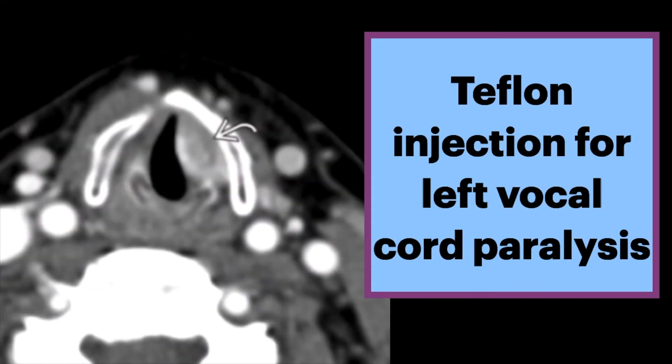There are a variety of treatments, including Teflon injection, which is shown here. This axial CT shows an amorphous high density in the left true vocal cord. Review of the history revealed a prior Teflon injection for this indication. It's critical not to mistake this for malignancy, as Teflon can cause a granulomatous reaction, resulting in a false positive PET scan.